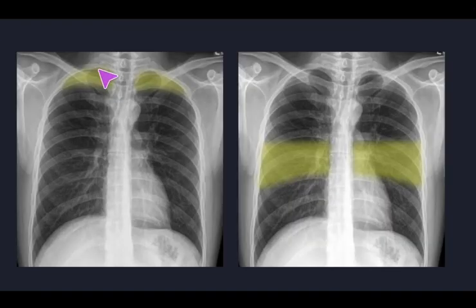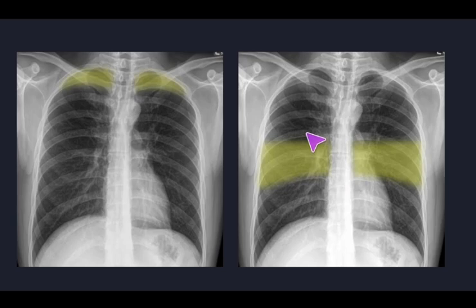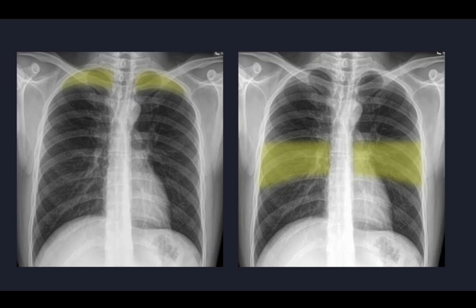The apical zone is at and above the clavicles. The upper zone is from the level of the clavicles to the superior hilar margin. The middle zone is between the superior and inferior hilar margins. The lower zone is from the inferior hilar margin to the costophrenic angle.